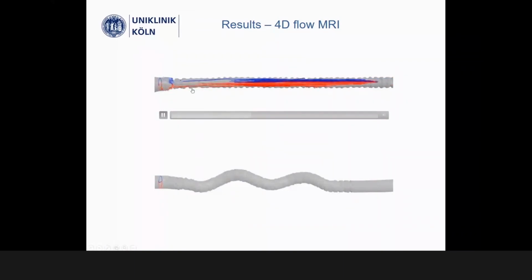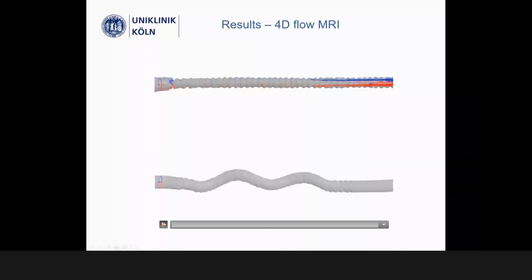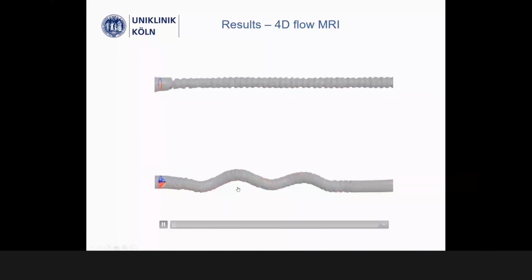And this is the 3D biomimic stent in a straight tube, in this very stiff tube, where the stent was not able to exert its 3D conformation on the vessel, whereas in this more compliant tube, it took up its natural configuration, and we were able to show very nicely using MR imaging that this helical flow actually gets induced. As opposed to the CFD images, which are only simulations, here we were able to show that it's for real, the helical flow.